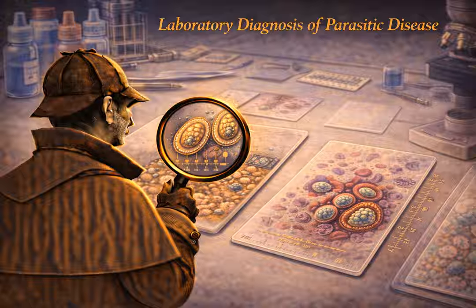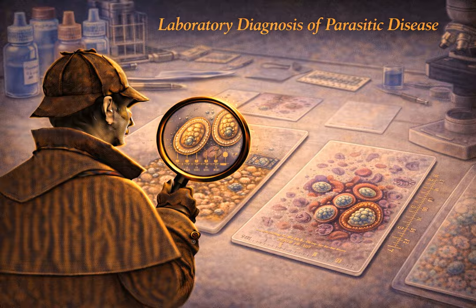What about formed, solid stool? Formed stool usually contains cysts. Because the stool moves slowly through the colon, the parasite had time to prepare for the outside world. Cysts are the dormant, hardy, highly infectious stage. They have a very thick protective wall, so they can survive much longer outside the body, hours or even days, depending on the conditions. So you have a lot more breathing room with a solid sample. But even then, getting into preservative quickly is always best practice.